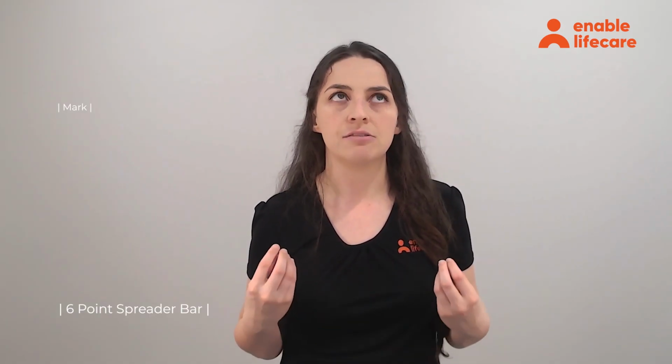So for 6-point spreader bar, we have Mark. He's a client with muscular dystrophy, and he really struggled with feeling like his shoulders were kind of compressed in or internally rotated with a 2-point as well as a 4-point spreader bar.